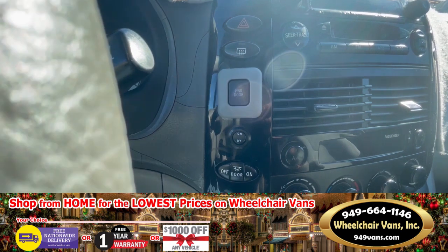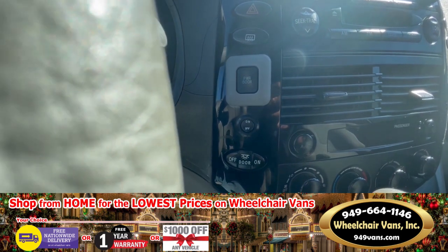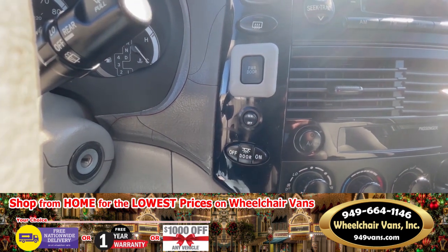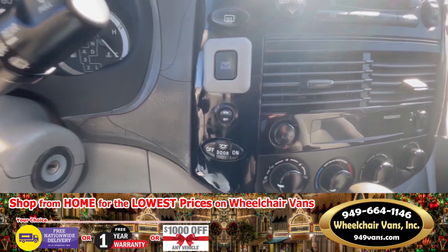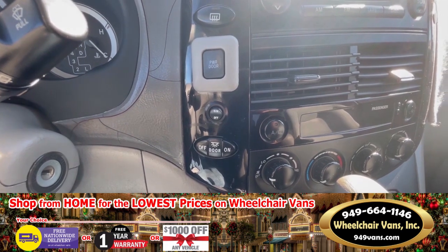When you're parallel parked next to a curb and you want to load the wheelchair from the curb — not necessarily parking on a flat surface — the kneeling suspension of the vehicle can actually be turned off by simply pressing that button. The door system will engage, the ramp system will deploy, but the car will not lower itself, and the ramp will deploy over the curb for you.